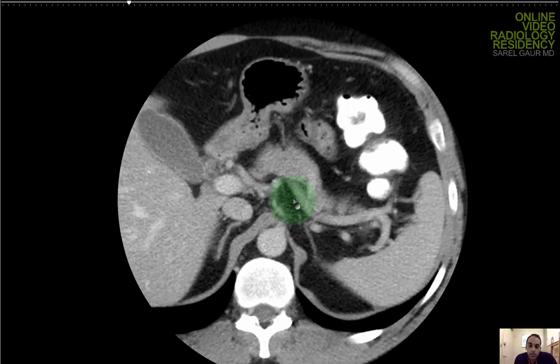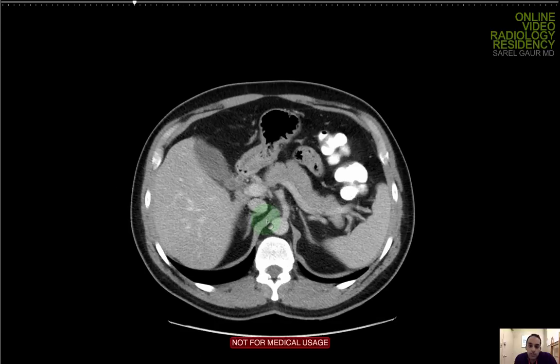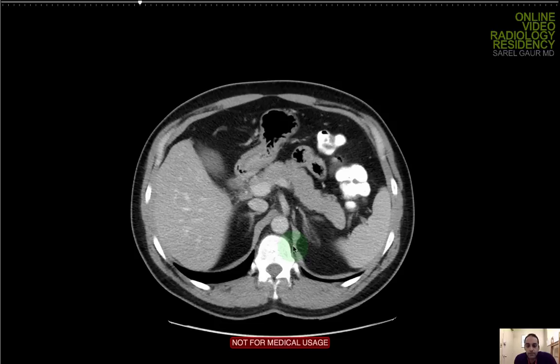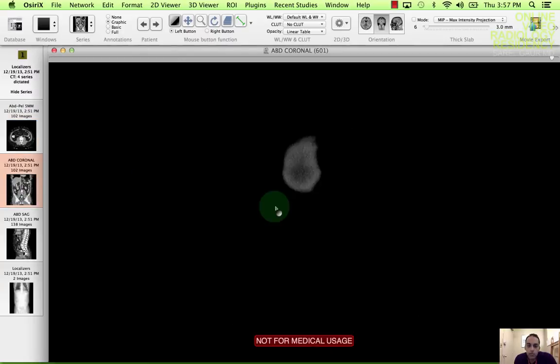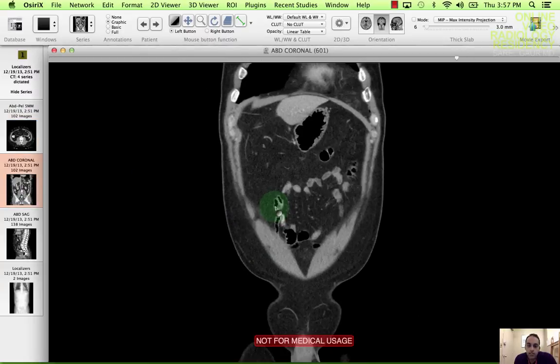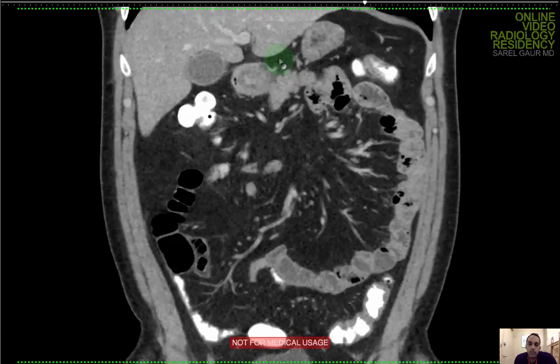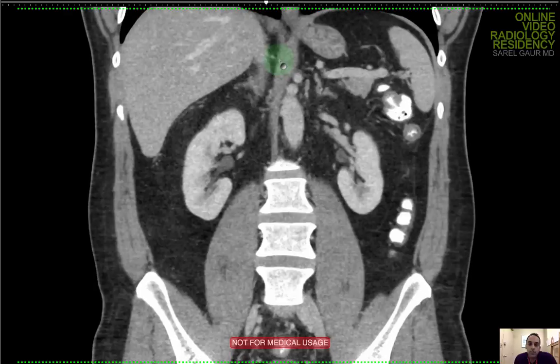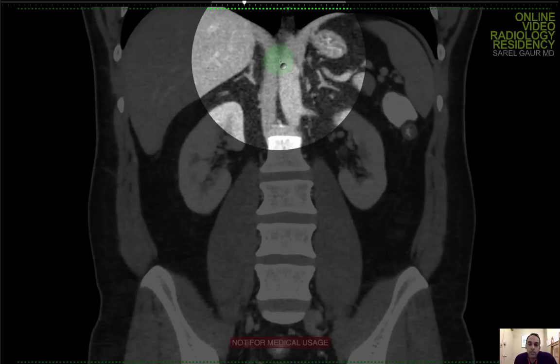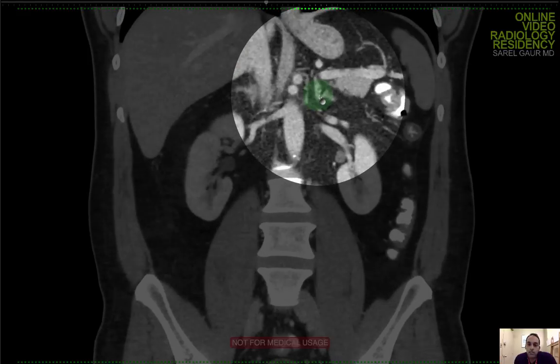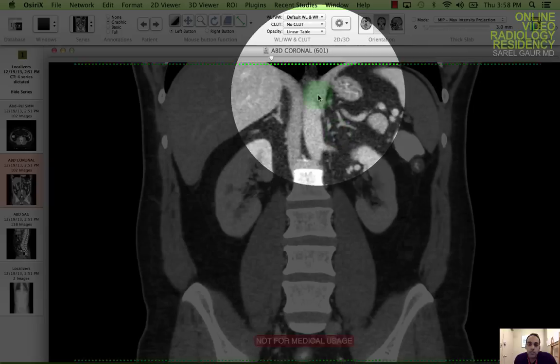I'm going on to the adrenals. Here's the right adrenal and here's the left adrenal. Looking for any adrenal nodules. I can see them nicely on the coronal plane — they're basically a Y-shaped organ. There are no adrenal nodules. The adrenals are unremarkable bilaterally.